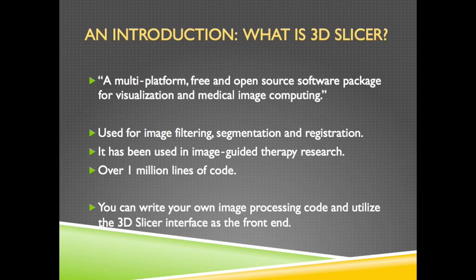The first point, what is the 3D Slicer? The 3D Slicer actually is multi-platform. It can be downloaded on different kinds of operating systems. It's a free and open source software package, so you can download it from the original website of the 3D Slicer. It has been used for visualization and medical image computing.